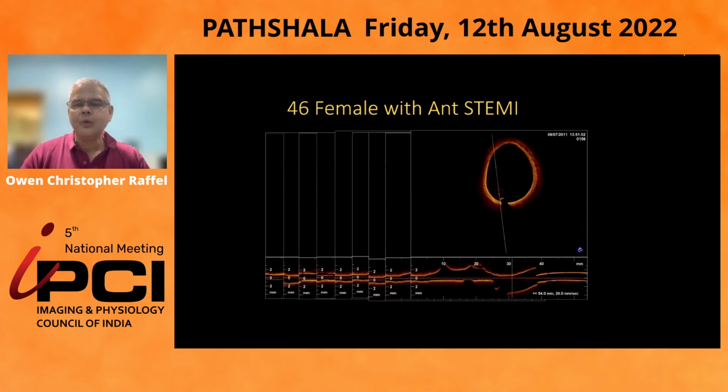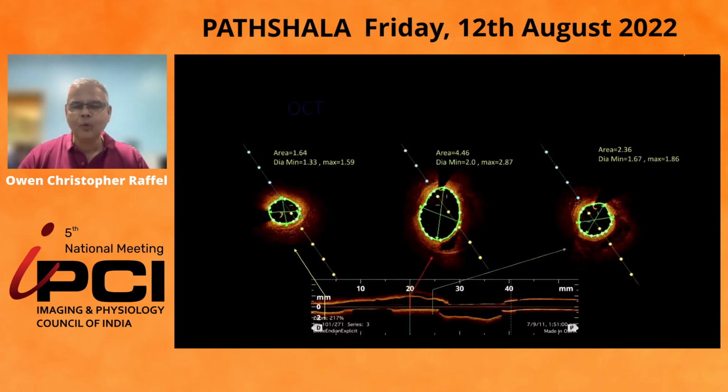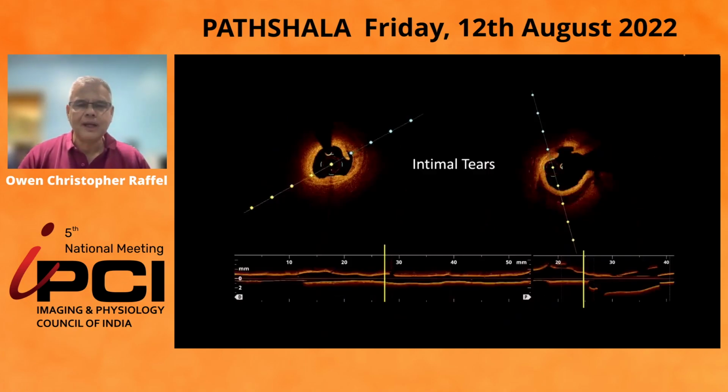And of course, how are we going to size it? Sizing is very important. So in general, what I tend to do is look at the largest lumen. You can't do media to media here. Look at the largest lumen and probably upsize by about 0.25 and go very gently initially, because you can post-dilate if you want to later.